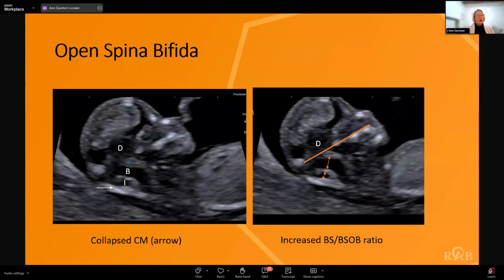You can see the face a lot more clearly. So we're getting a lot more information. We're tending towards that slightly later time, especially because a lot of our pregnant women are getting the non-invasive prenatal testing anyway. So they've already got an answer to that. So we're looking more for early anatomy. I hope that answered that question.